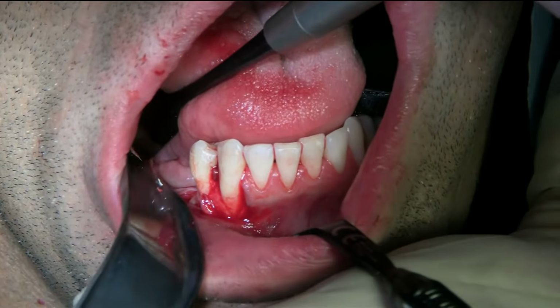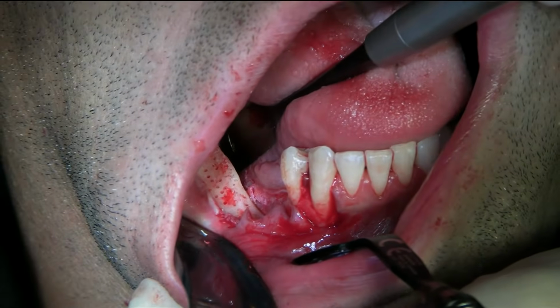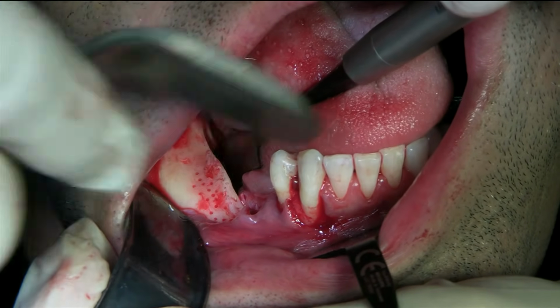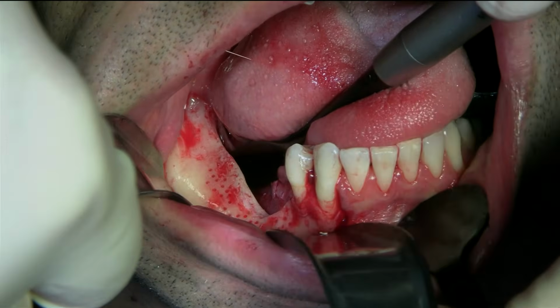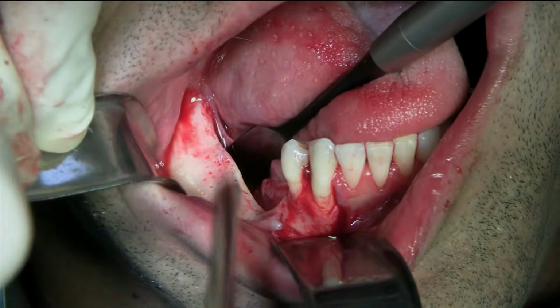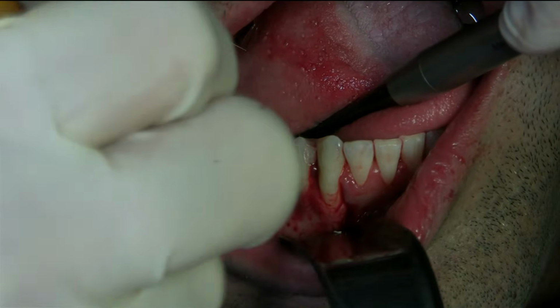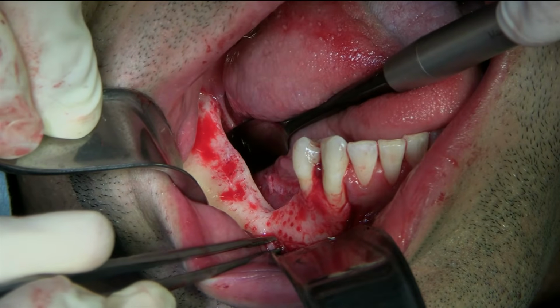Okay, we're good with this, so like we're gonna show that. Need a second Minnesota? Yeah. Make sure, careful with the mental foramen. We can take a photo. You just retract it and you can take a photo. Okay, retract. Okay. So mirror, give me a mirror so we can show that. So now actually the ridge is completely ready.